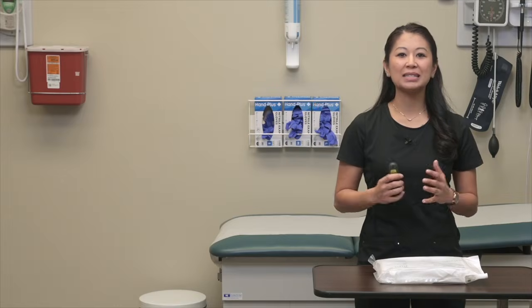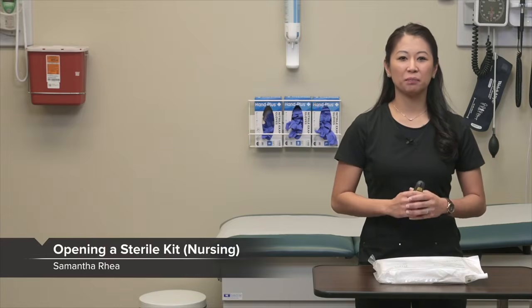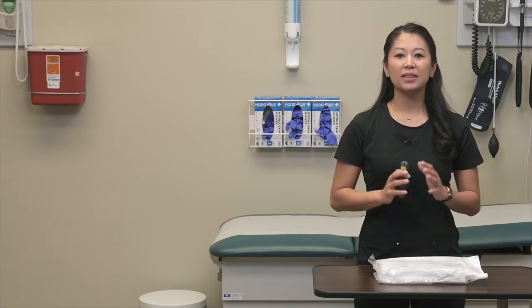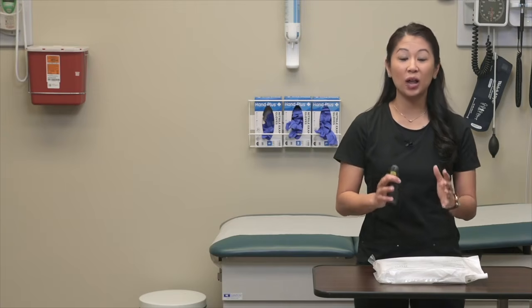Welcome to preparing a sterile field and sterile gloving. In this skill, I'm going to show you how to prepare a sterile field. This is used for lots of common nursing procedures, inserting a Foley catheter, for example. Then I'm going to show you how to add sterile items to that field and also how to sterile glove.